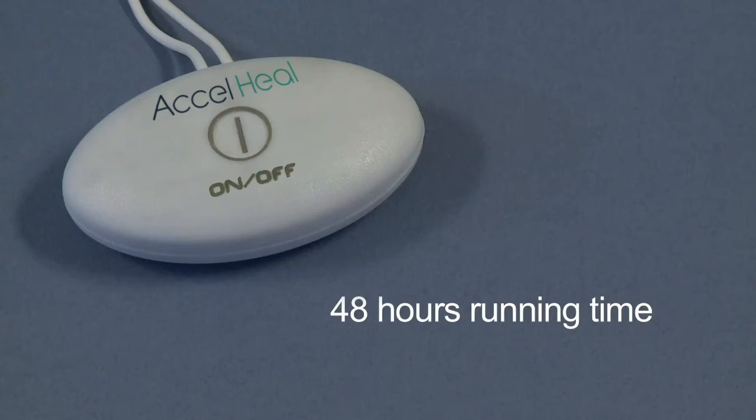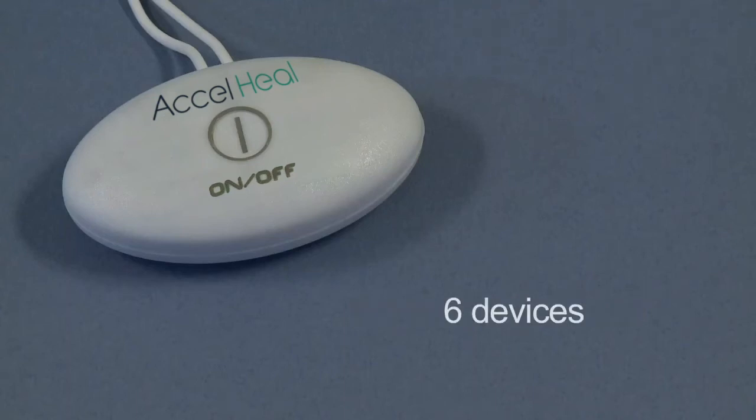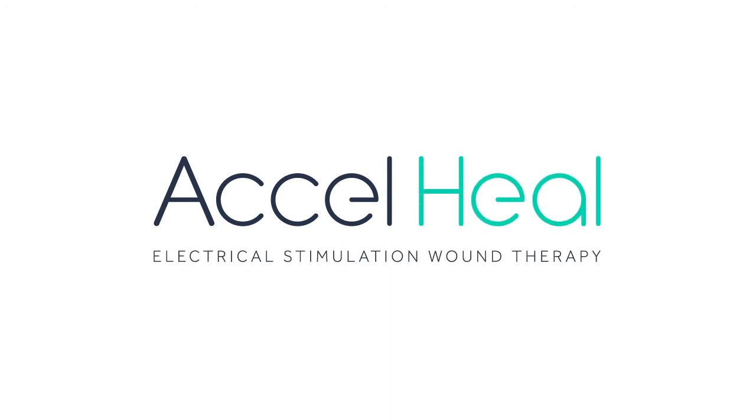Each Axel Heal treatment device runs for 48 hours, after which time it will switch off automatically and need replacing with a new one. The treatment consists of six 48-hour devices, making it a 12-day treatment course. A further instruction video on device change is available.